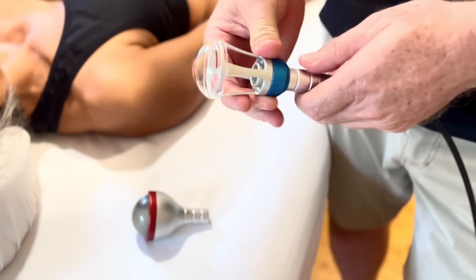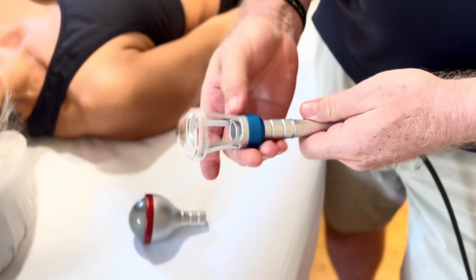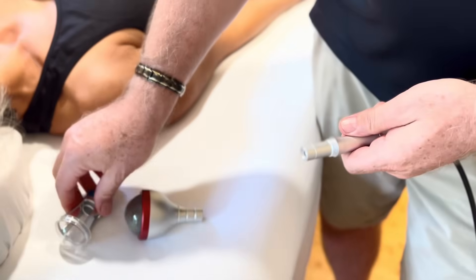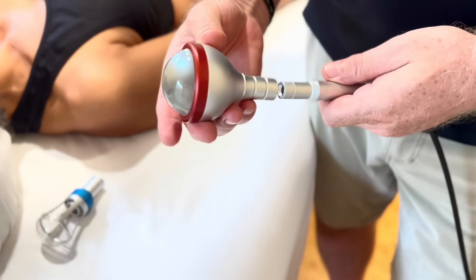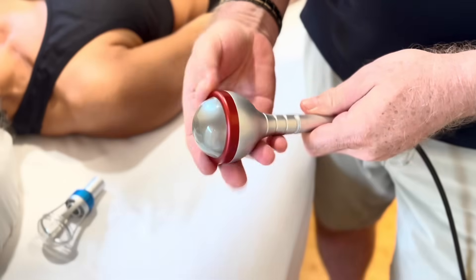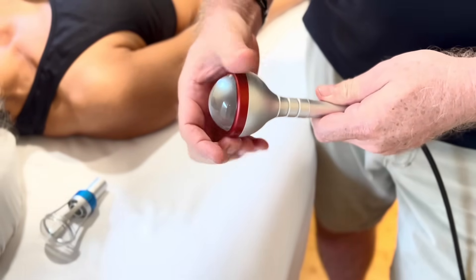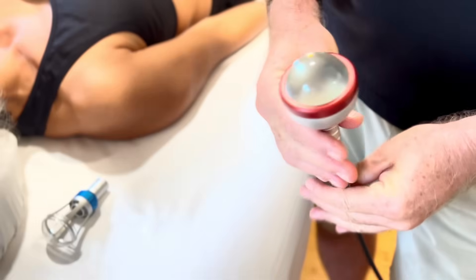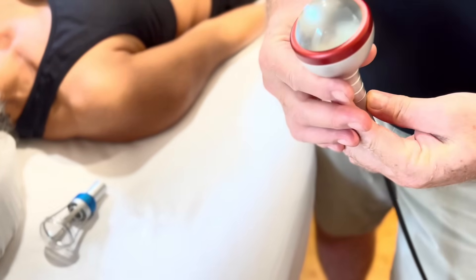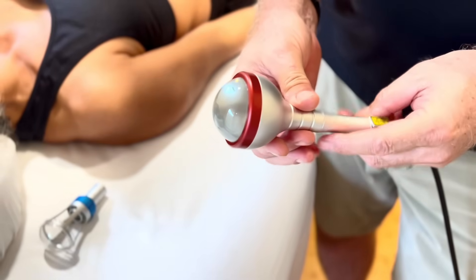So we've got here the Remy Laser zoom emitter — this is the standard emitter with the safety switch. It's actually really easy to take this off and insert the Remy Roll roller ball emitter, just that easy.